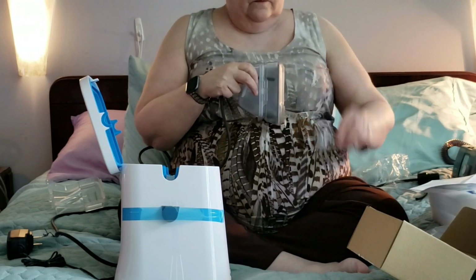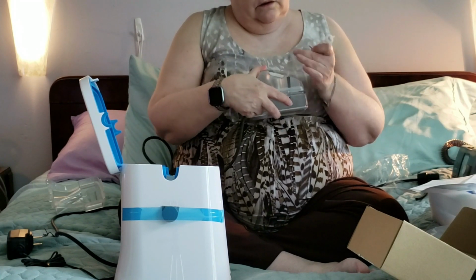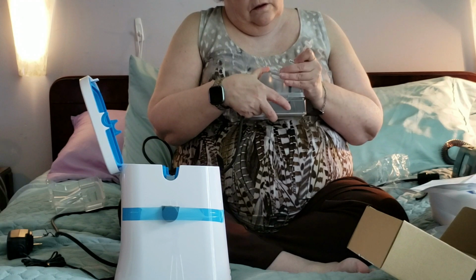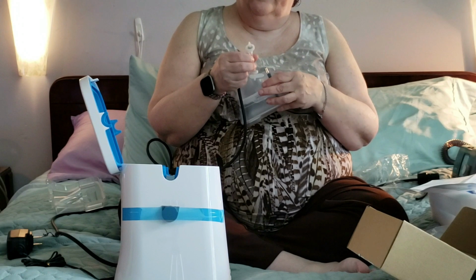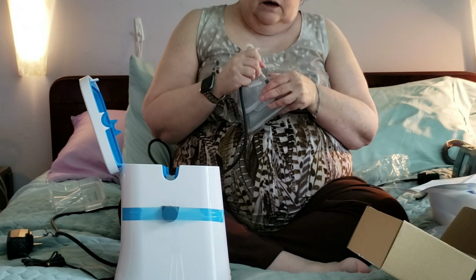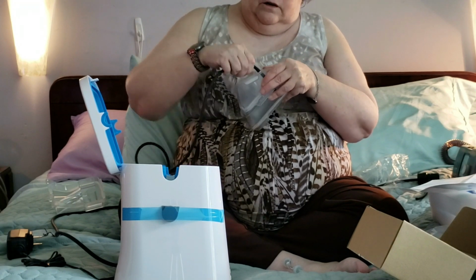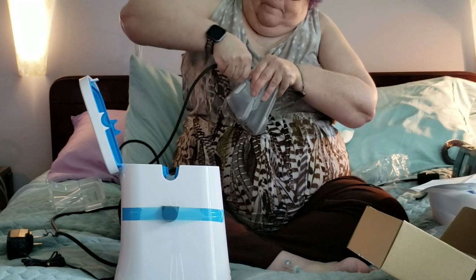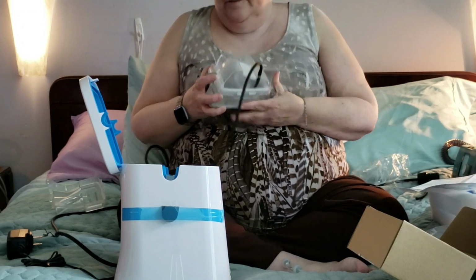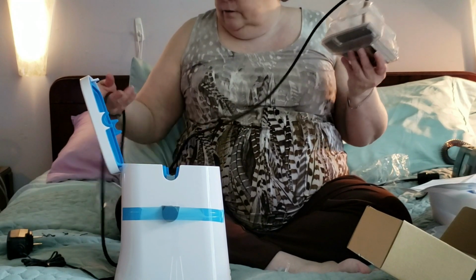Oh, I guess this whole piece came off too. Maybe. Yeah, this doesn't fit into the CPAP, into their own adapter, so I'm guessing it's just the rubber tube. There we go. And then what I will do, see, this is all attached now to the SoClean.